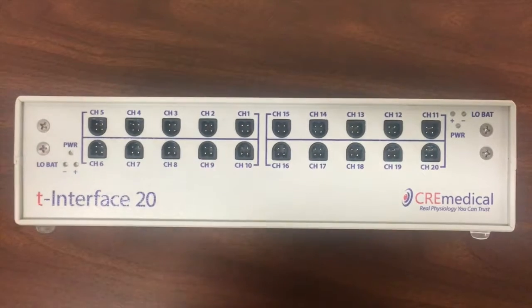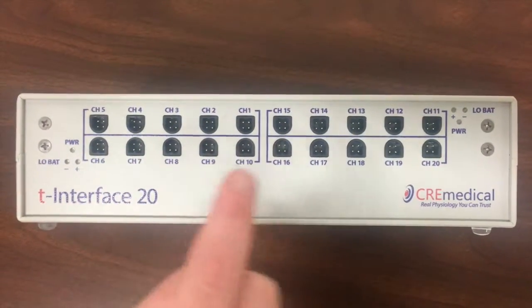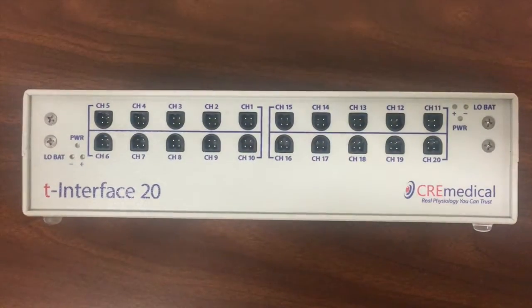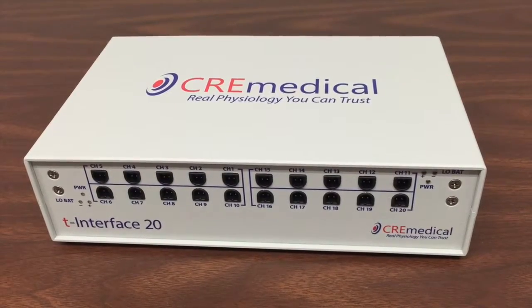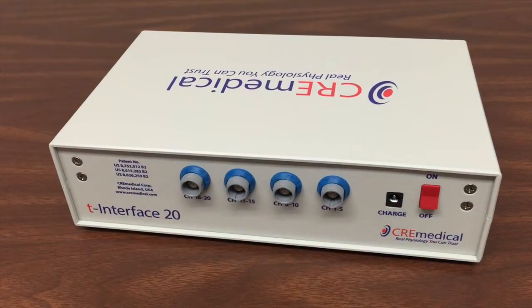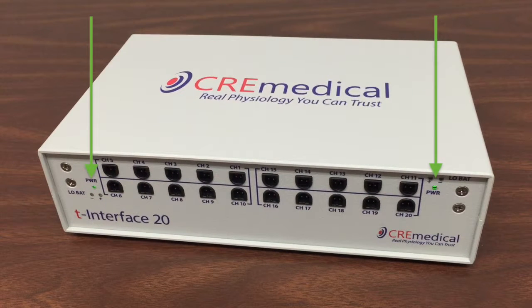Part 3. Connecting T-leads, the T-interface 20, and an amplifier. This is the front of the T-interface 20. It has 20 input channels, numbered from 1 to 10 and 11 to 20. Prior to plugging anything into the T-interface 20, turn the T-interface 20 on. Ensure the 2 green power lights are on. If one or both lights do not turn on, turn off the T-interface 20 immediately and call CREmedical customer support.